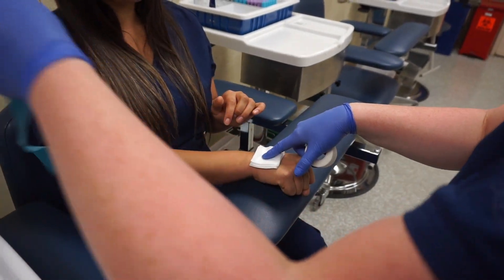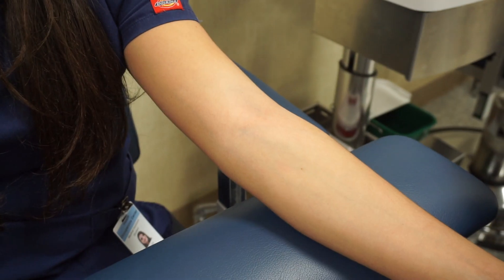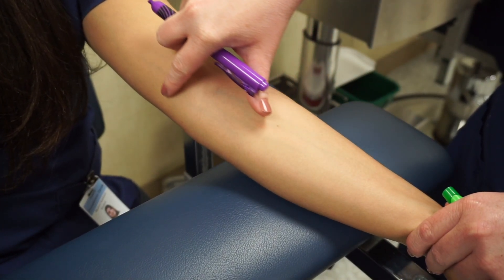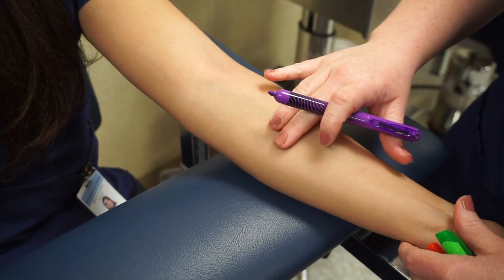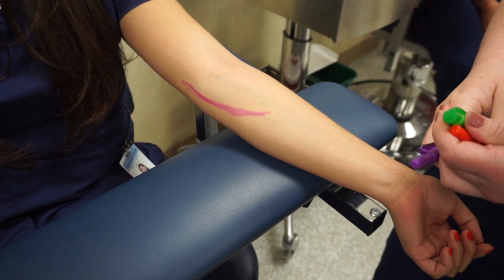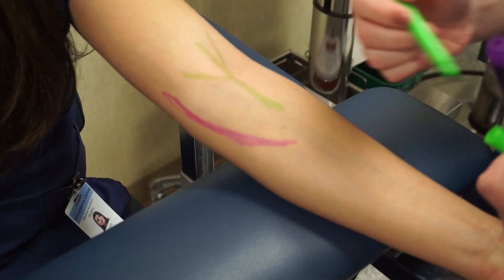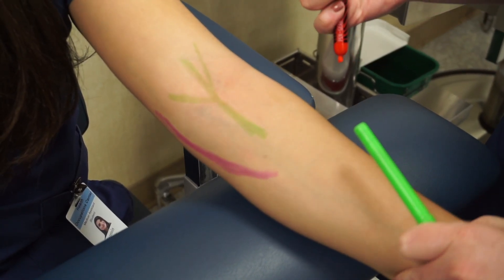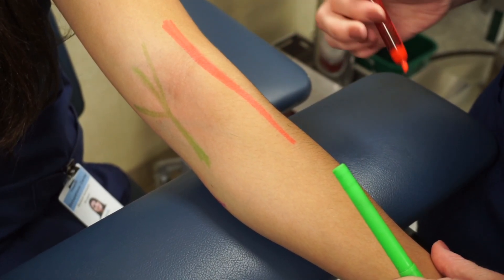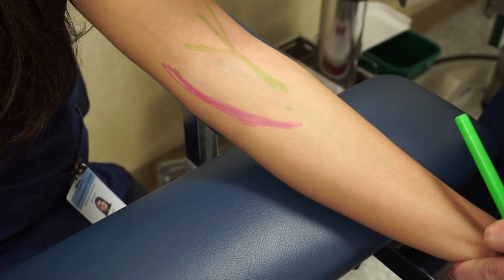Ask the patient: can you make sure that you apply pressure on that for a little while so it doesn't bruise? Now I'm going to show you the three veins that you need for an arm draw. The first one is the basilic, which runs along the inner part of the elbow — this is your last resort because it is near the brachial artery. Next is the median cubital, which is the most popular one, with multiple veins running down the middle. The last one is the cephalic, on the outside of the arm — this is your second resort. And when you're doing the basilic, always feel for a pulse first.